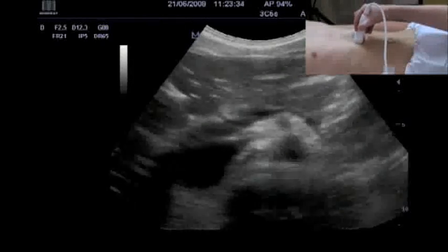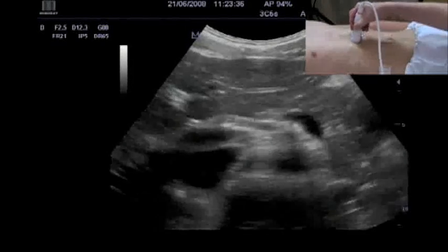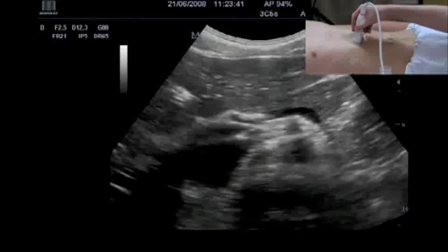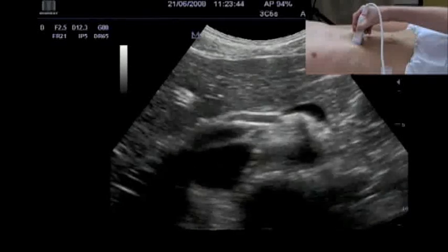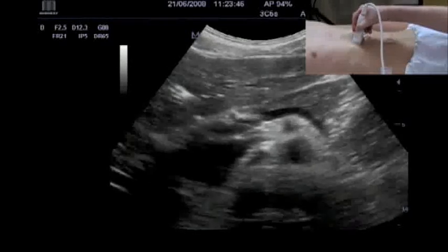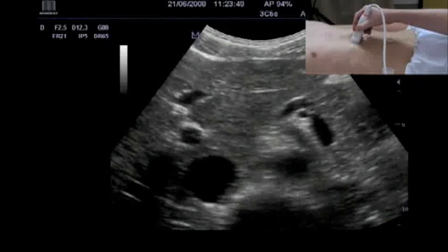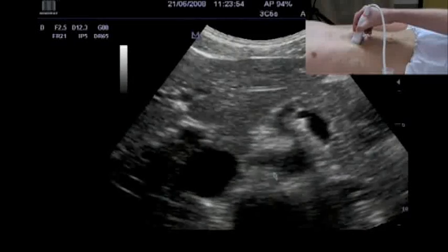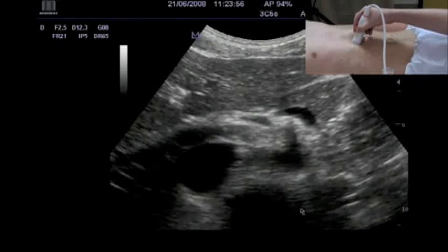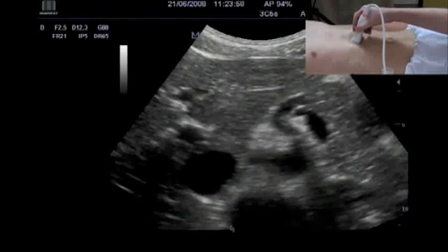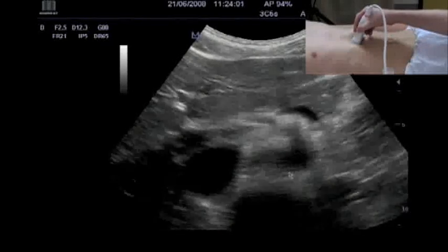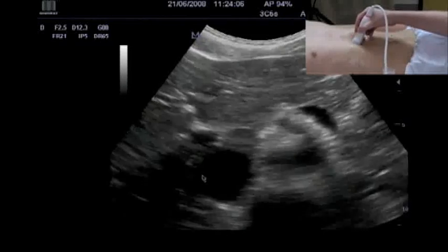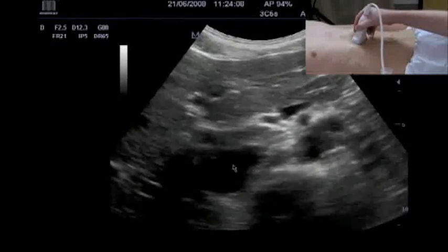Let me move to the transverse plane, transverse section. Here the right of the patient is on the left of the image. We look first for the different vessels and structures that we can recognize. What do we recognize from dorsally? Here is the spine, then we see here the aorta, and to the right the inferior caval vein.